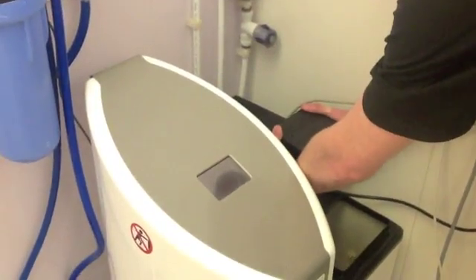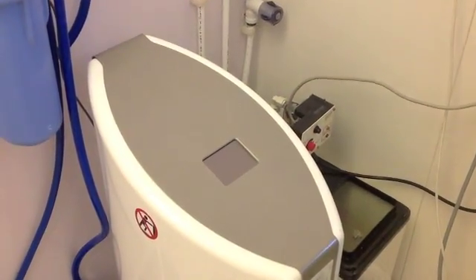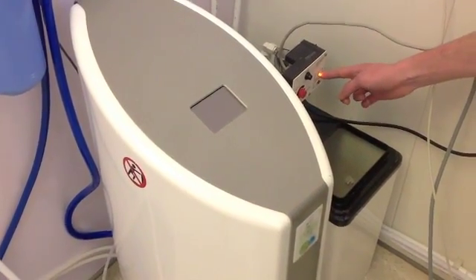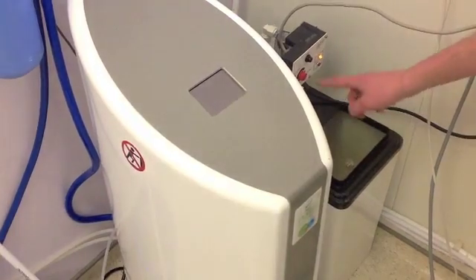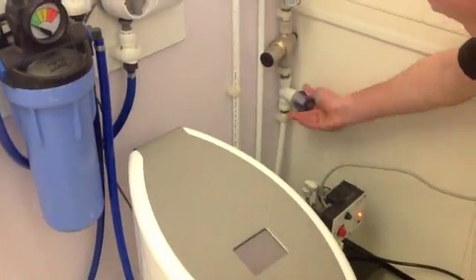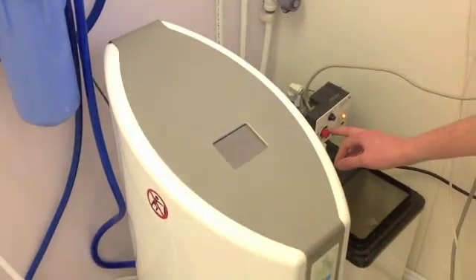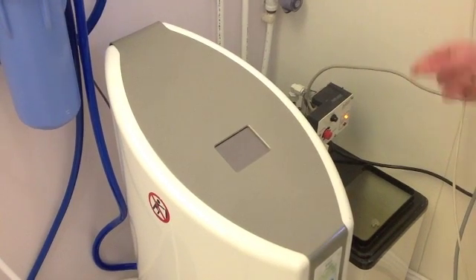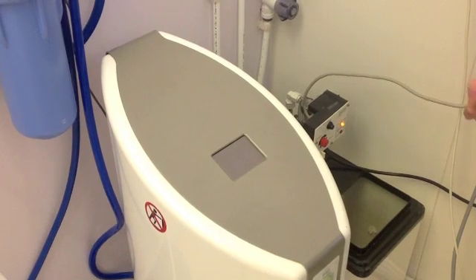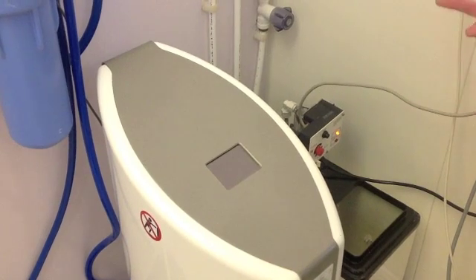When you are regenerating it, which is once a week, you turn on your power and you will get a light up here. All you need to do is make sure that your water is on here, and then you push in this red button. You will hear a click, and then a couple of seconds later you will hear another click. That is usual — it is supposed to do that — it just means that it has started its cycle.